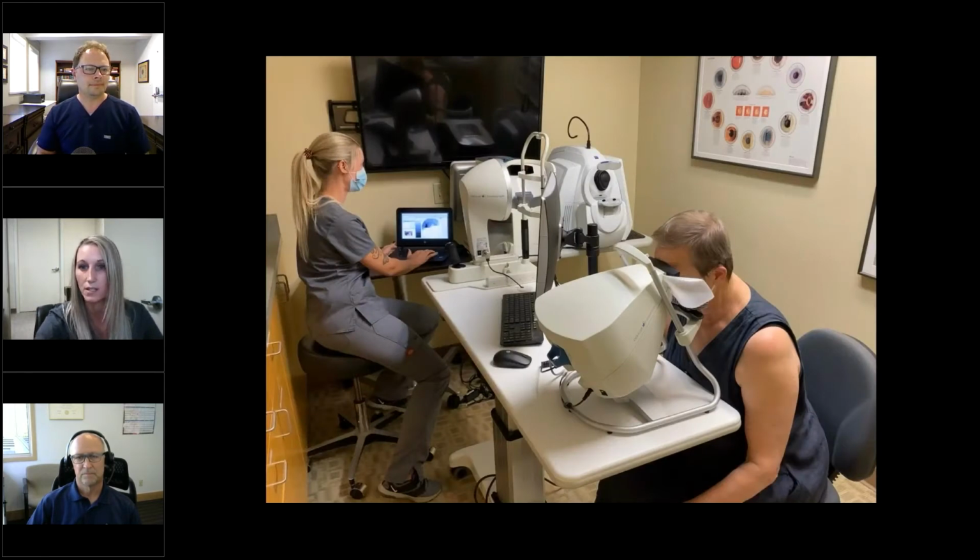So with this one, as you can see, she is leaning in to the machine, and the patients, I did a comparison, and I asked them which one they would like better, and they loved this one. They said they were more comfortable, they were leaned in. I wish I would have taken a picture. The trial lens is actually stuck in there, so it doesn't have to touch their eye. So they really enjoyed that. They liked that. They didn't have to wear a patch. It went faster. So even if they're missing a whole bunch, it's still 3 minutes per eye. So they just preferred this machine over the Humphrey.